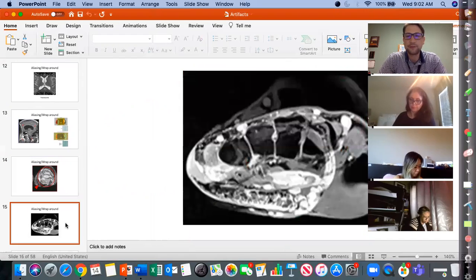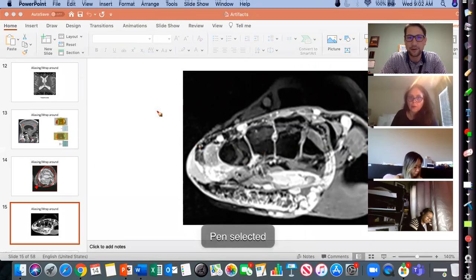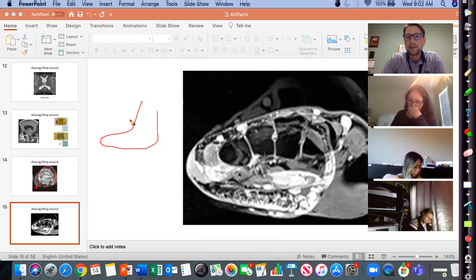All right, and then this was that example of the forefoot and the heel. So in this situation, if you can't really understand what's going on, imagine the foot is like this. We usually divide up the foot and ankle when we're scanning, or at least those that have been to MSK sites, and we'll talk about it today in lower extremity.